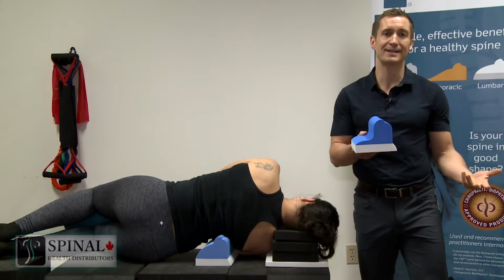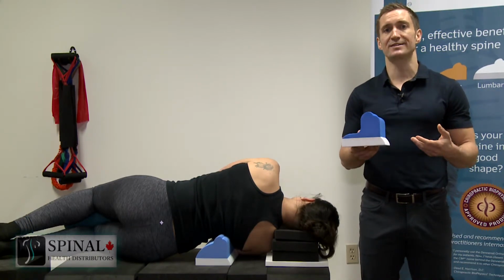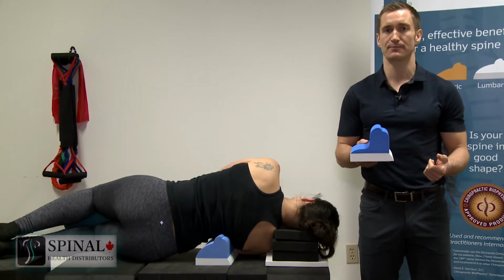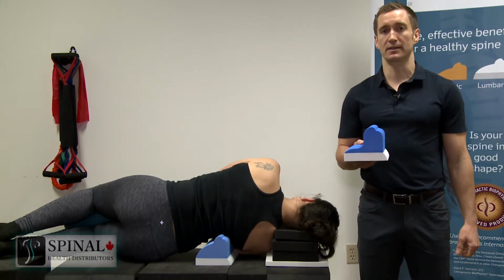Okay. Contraindications are your typical red flags. So things like fractures, instabilities, infections, or worsening of the patient's existing symptoms. If any of those things occur, I have the patient stop and then check back in with me.